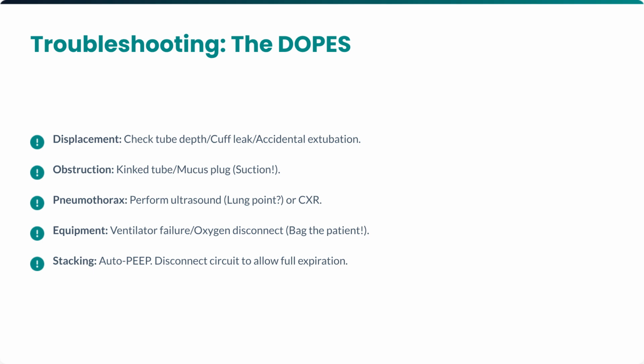Troubleshooting high pressures is simplified using the DOPES mnemonic, covering displacement, obstruction, pneumothorax, equipment, and stacking. For stacking, disconnect the circuit to allow full expiration.